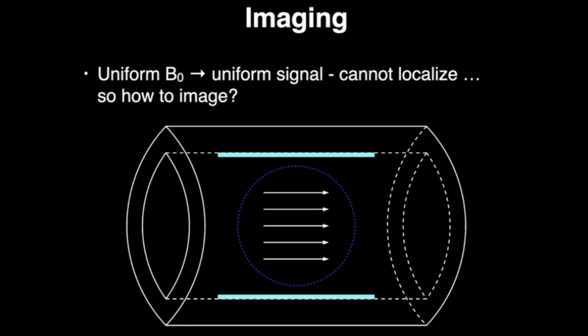In our MR systems, shown schematically here, the big outer tube is our main strong magnet, our 1.5T, 3T, 7T magnet. And then there's some volume shown in blue here at the center of the system where it's actually 3T or 7T to a very uniform degree.